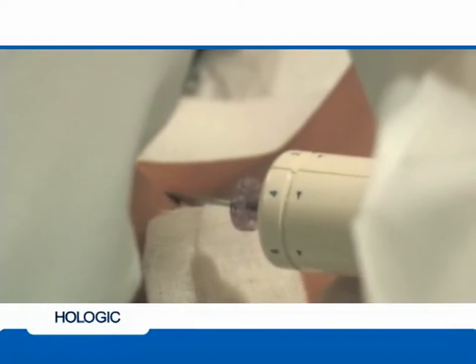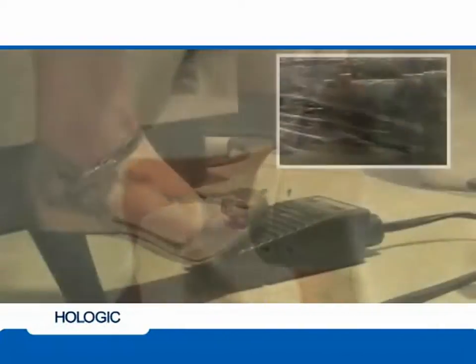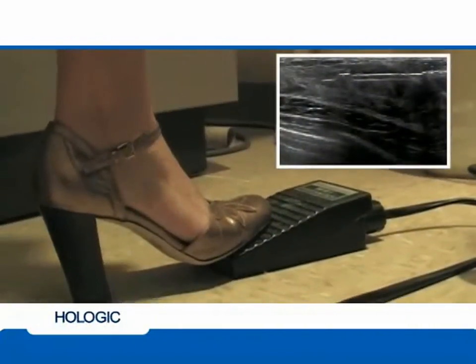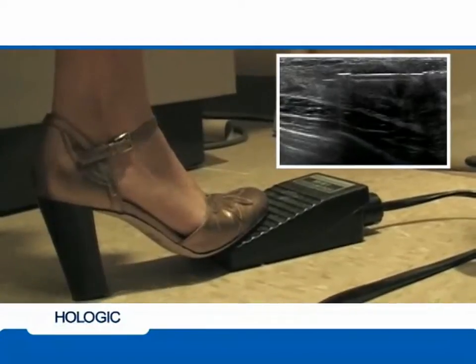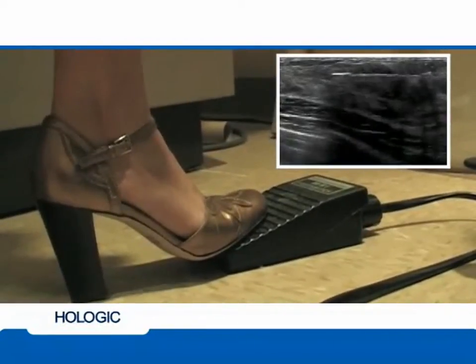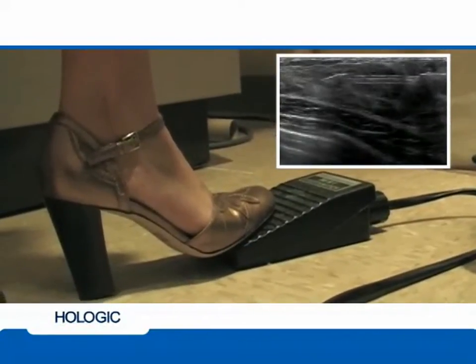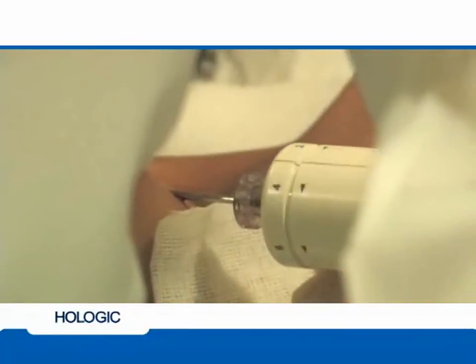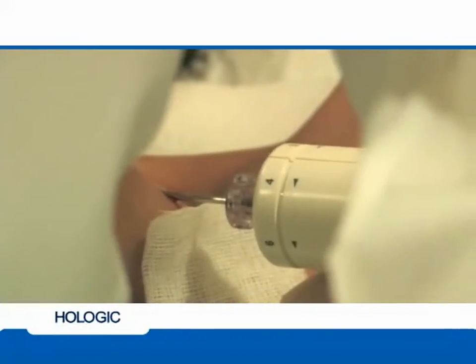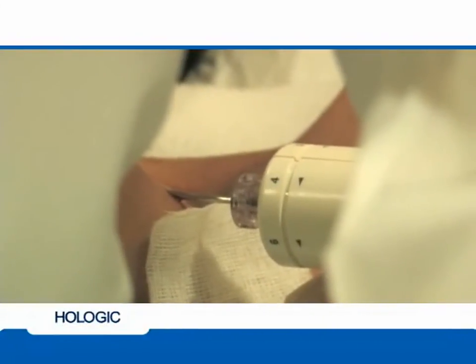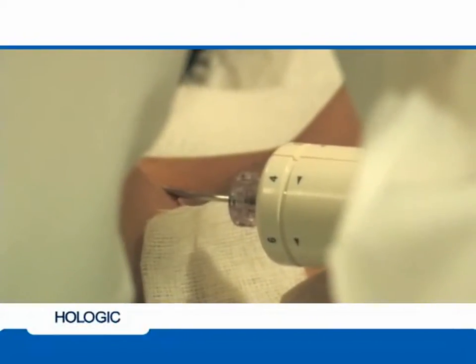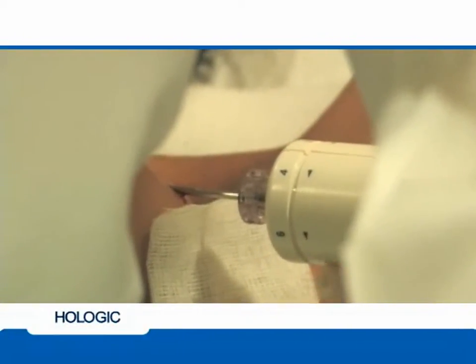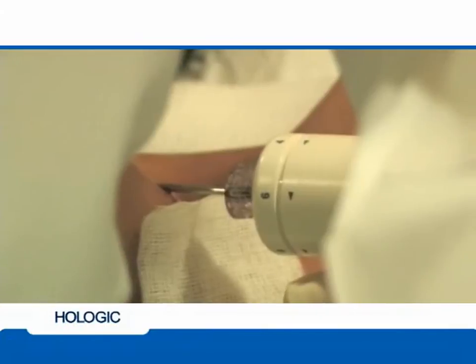When satisfied with your needle position, begin taking tissue samples by depressing the foot pedal that will activate the cutting cycle. It will take six seconds for the initial vacuum to build before the system will start sampling.